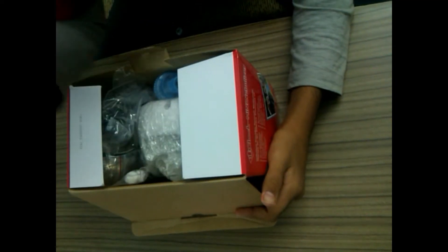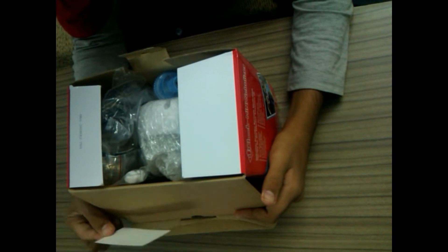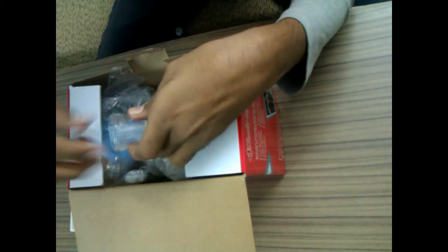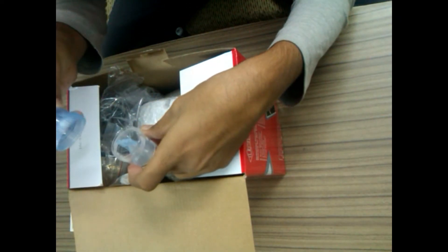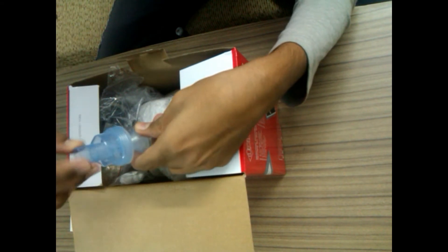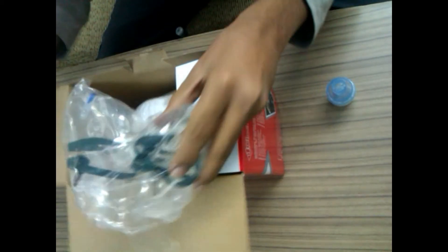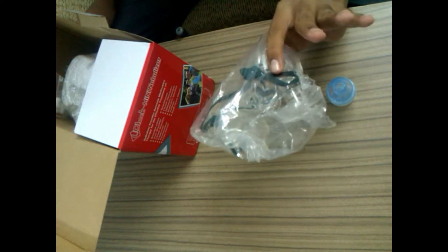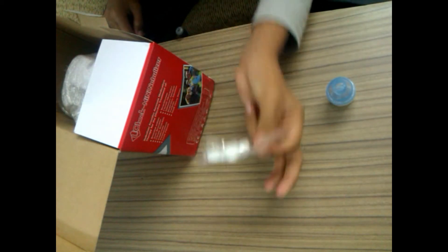First of all, we get the cup for this — this is where you put the liquid medicine in. There is the mouthpiece, as you can see. These are also the air filters.